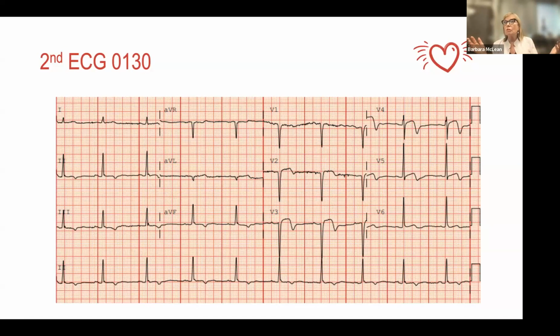And is this just a non-STEMI with diffuse changes? I'm not really too sure, except for one thing. That troponin level for a non-STEMI, a troponin jump like that, that's an emergent event. So whether it's a STEMI or a non-STEMI, with that acute troponin jump, you need to get cardiology on board and you need to do it really, really quickly.